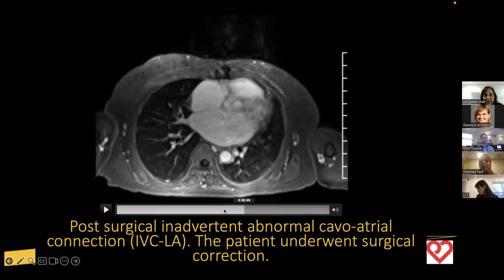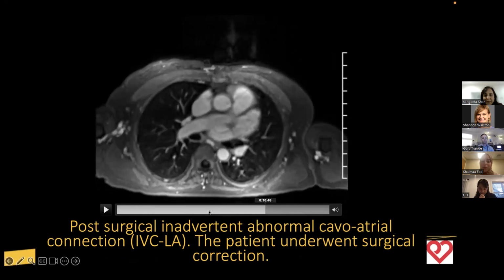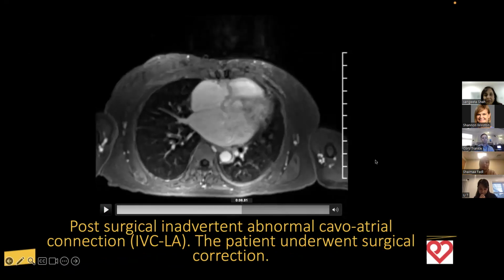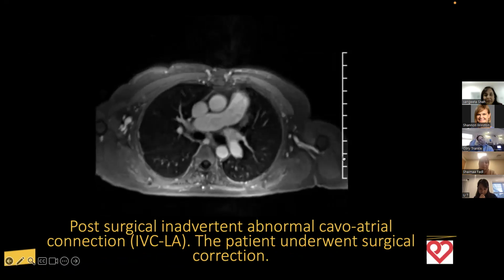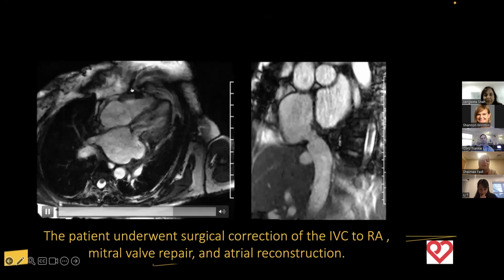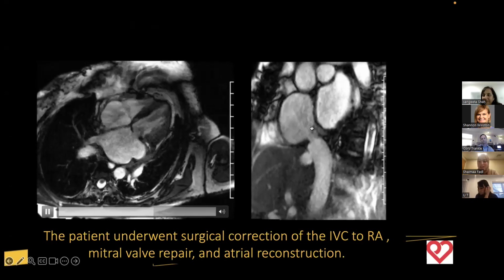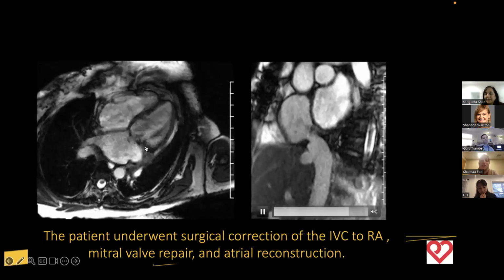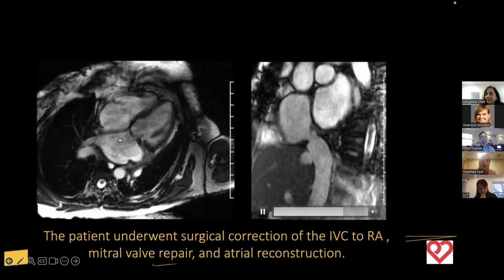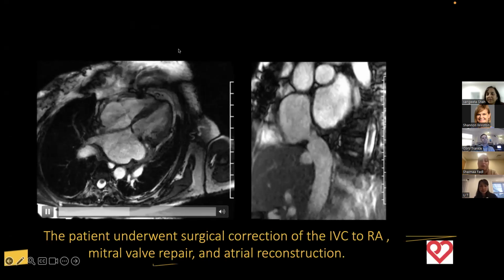I think there was a reported PFO, but otherwise there was no significant defect of that patch. And the patient, they took the patient to surgery. They did redirection of the IVC to the right atrium, to the correct direction, and they did a mitral valve repair, and they are doing follow-up for this patient.